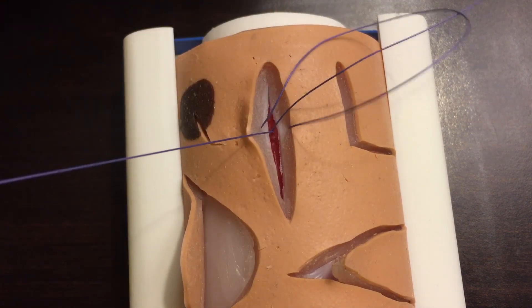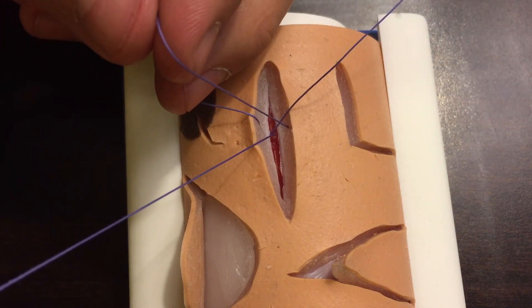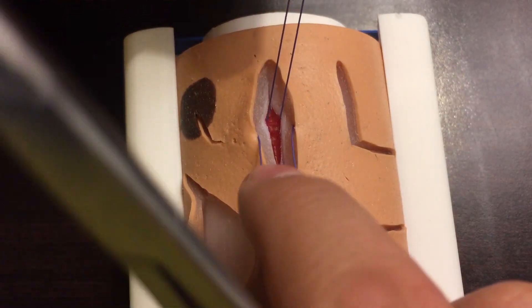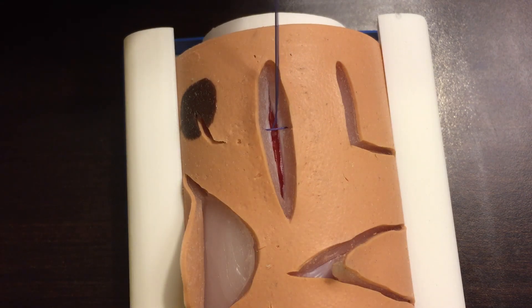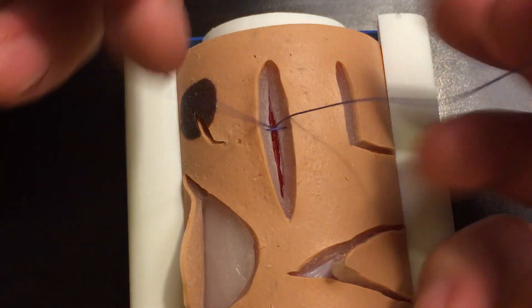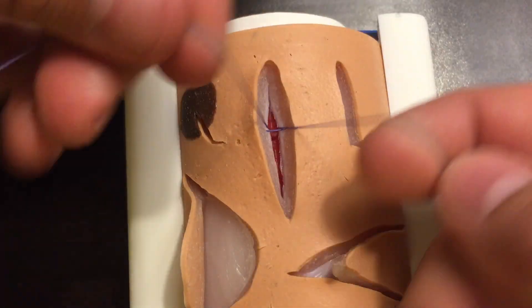I'll push this through now. You want to make sure — if I pull this up I've locked it in place — I've got to have both my tails on the same side, so I've got to be able to pull it like this, rather than having one on one side and one on the other. A lot of the suture we use like this in the operating room is going to be a vicryl pop-off, so you can just quickly pop off the needle. Now I've got two open ends of vicryl.